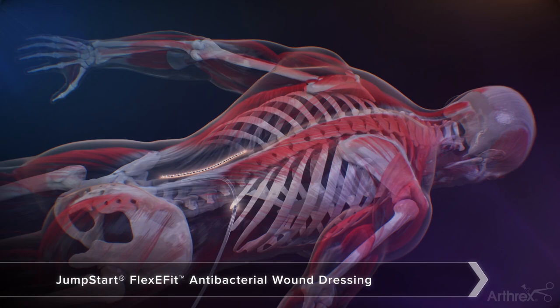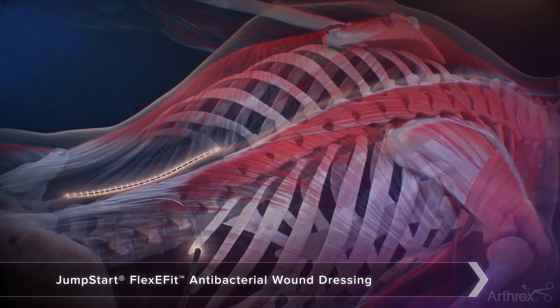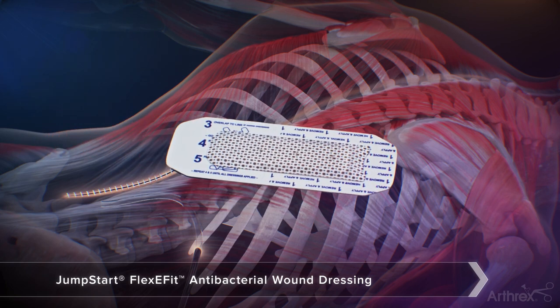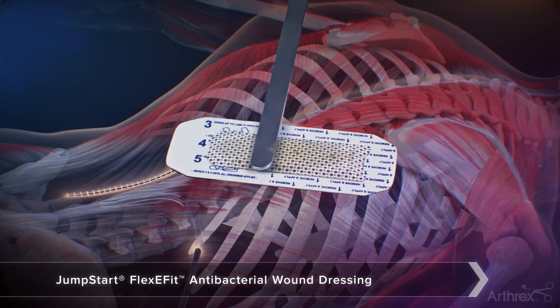For spine surgery, the Jumpstart FlexiFit provides the optimal solution for wound covering, as the dressing can be joined together based on the length of the patient's incision. Start by hydrating the FlexiFit dressing with Energel Wound Hydrogel.